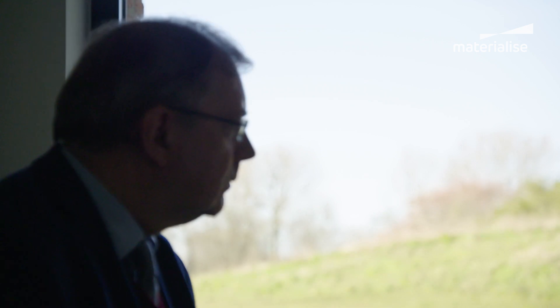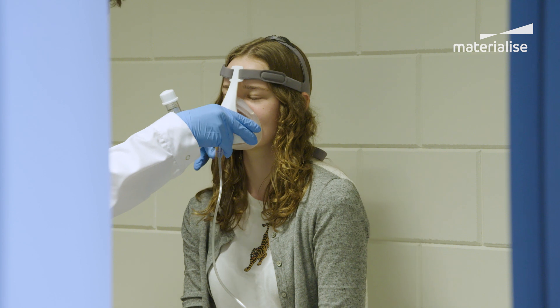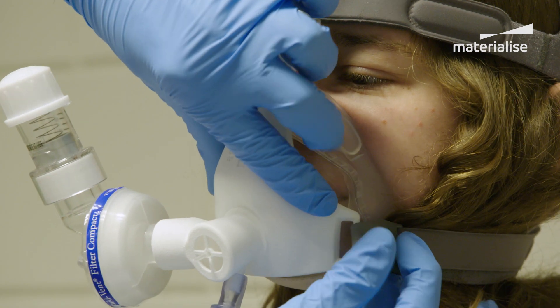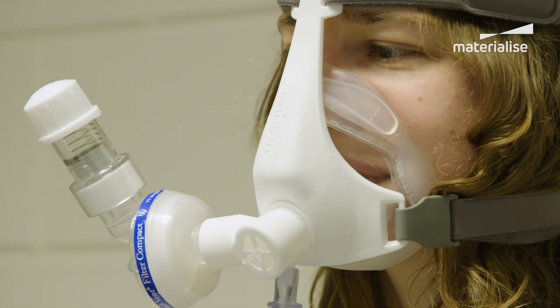So we think if we do that, first of all, it's a safe thing to do, because it's a fitting mask and there is no leak. That means there is not so much risk of spreading the virus in the environment. For the caregiver, it's a safe thing to do. And for the patient, of course, it's not so invasive.